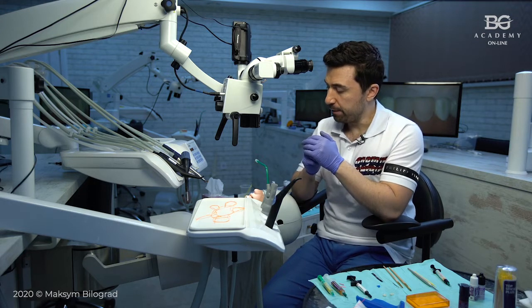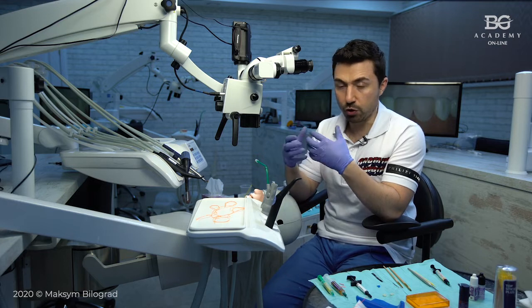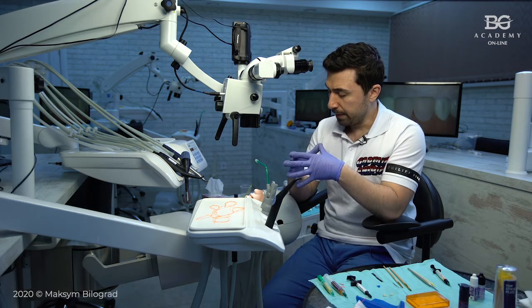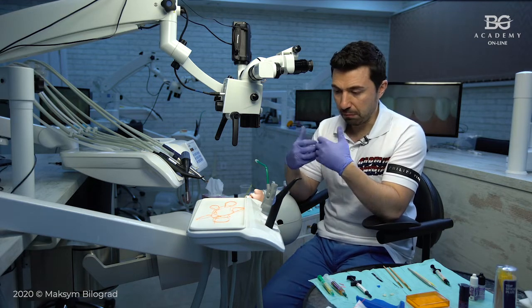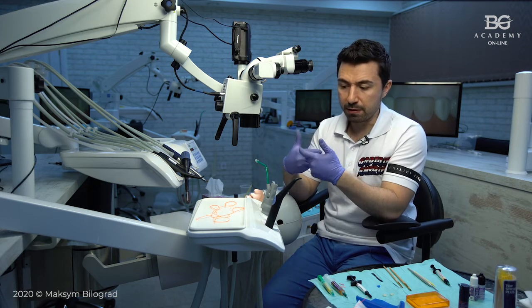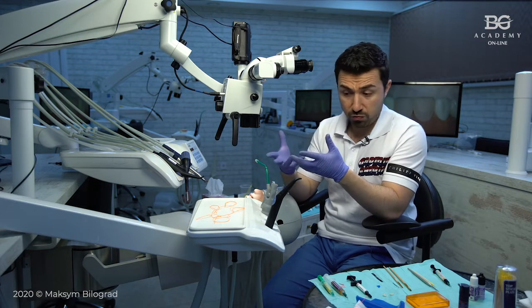Also, if your ceramic veneer is relatively thick, for example 0.4, 0.5, 0.6, 0.7 millimeters, and it is made of non-translucent ceramic, maybe your dental technician used more dentin, or they milled or pressed the veneer from more opaque ceramic.